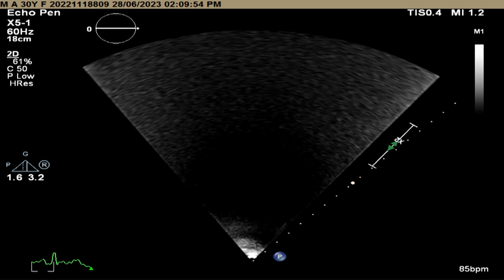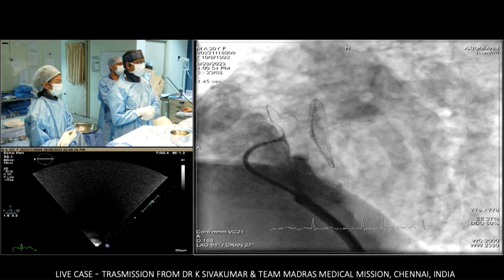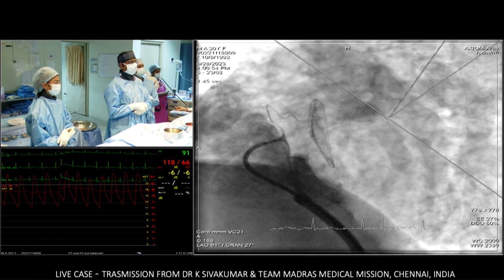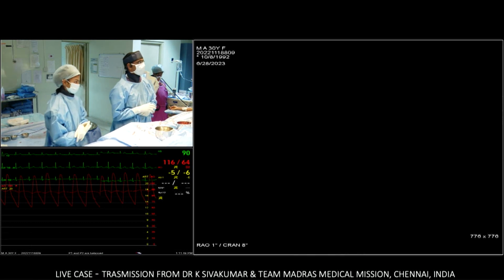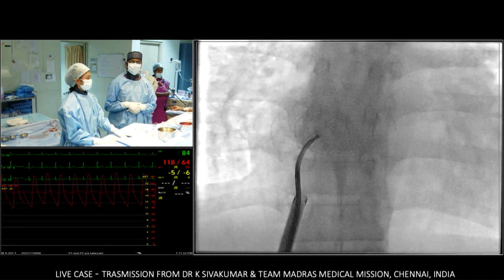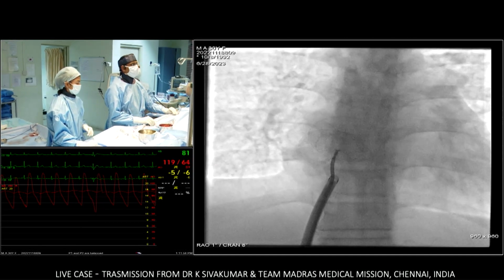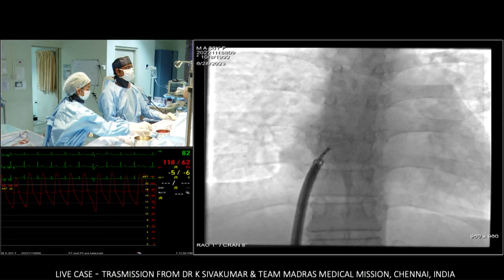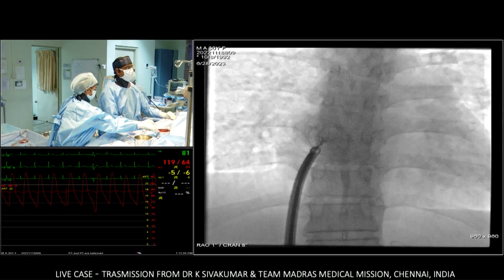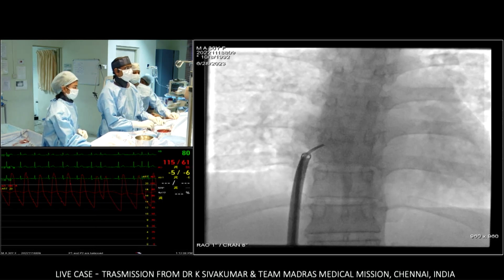Thomas, sorry, you got up. Hi, AP. Just one question before you release. In the standard ASD, you would do a wiggle maneuver, and if you pushed on the device, would you then get rid of the concavity? Just pushing on the sheath against the right atrial disc, would that be an option? Okay, I will try it, but being a Trevisio cable, I'm not able to play much with the cable because Trevisio doesn't allow it.